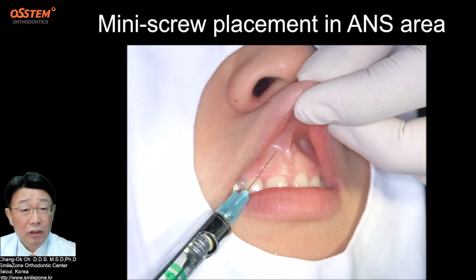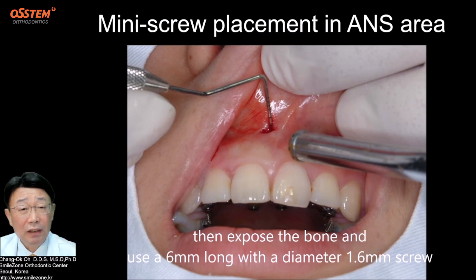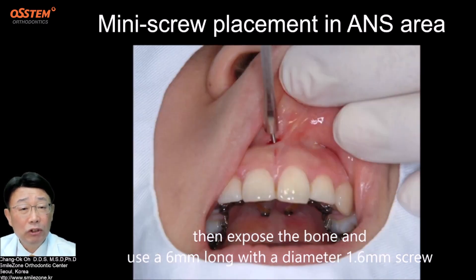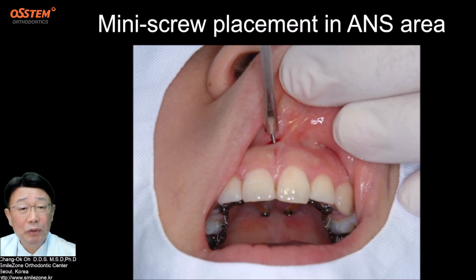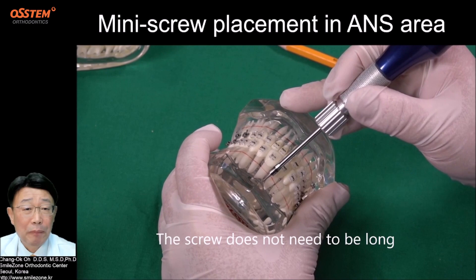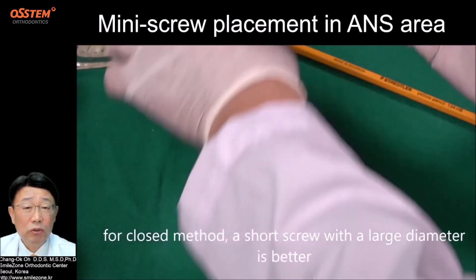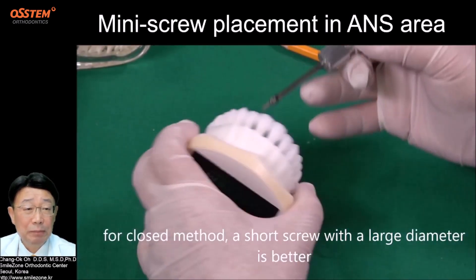After the injection, we should incise the tissue about 5 mm, then expose the bone and use a 6 mm long screw with a diameter of 1.6 mm. The screw does not need to be long — for the closed method, a short screw with a large diameter is better.